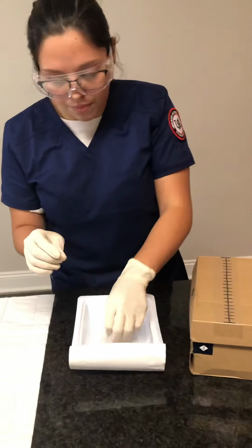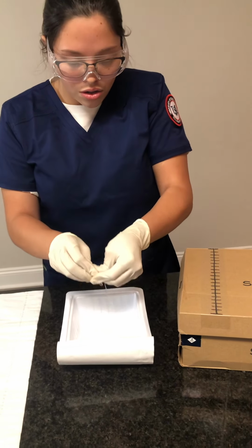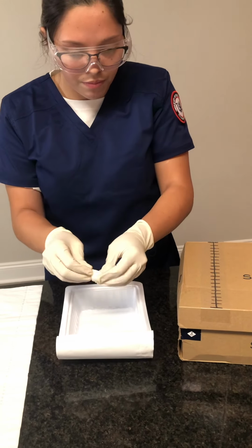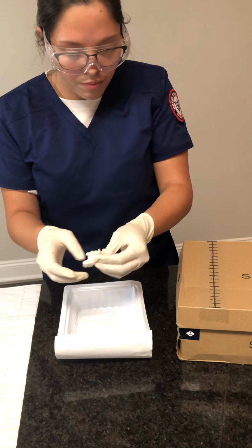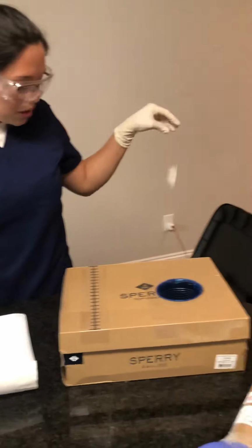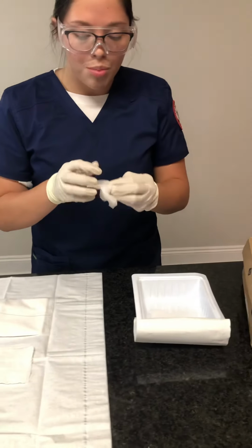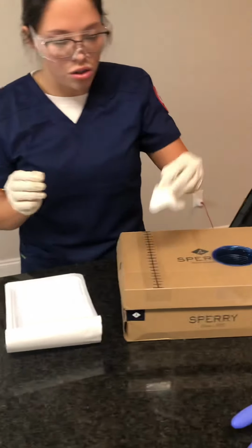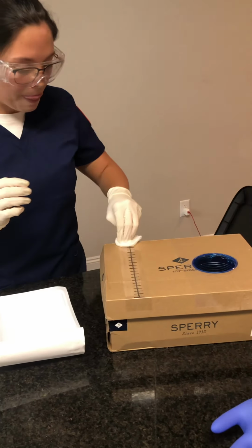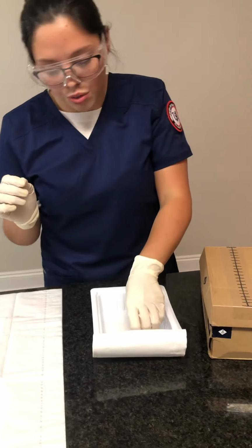And dispose of that. And then I will do the same process onto the left side, draining all the water out of the gauze. Making sure my gloves do not touch the skin. I will then take a dry piece of gauze to lightly pat any excess saline on the suture. And dispose of that. I will then pack the suture.